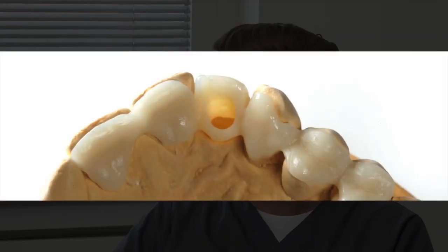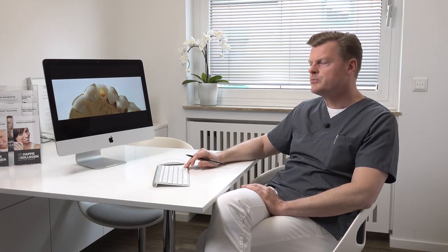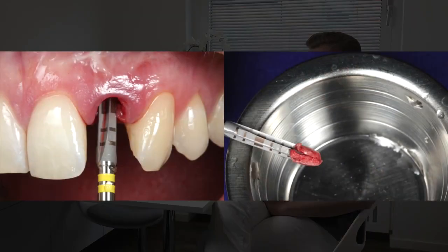Today we are able to restore these teeth immediately, and we fabricated this kind of shell provisional for the session. You can only place these kind of immediate temporary restorations when the implant has an insertion torque of over 35 newton centimeters. The surgical concept of immediate implant placement always tries to avoid raising a flap.